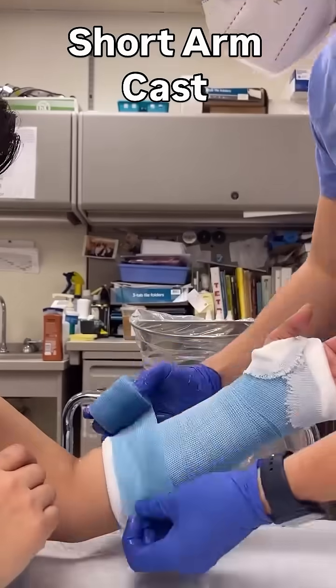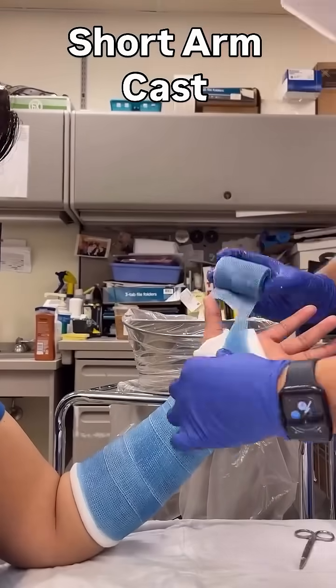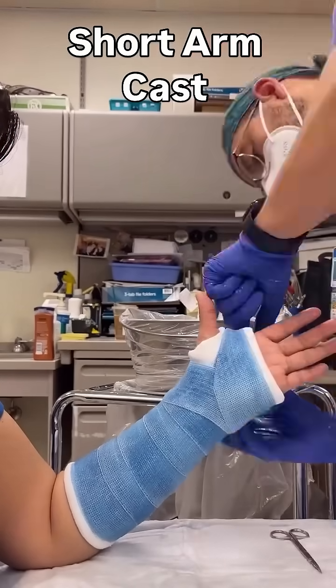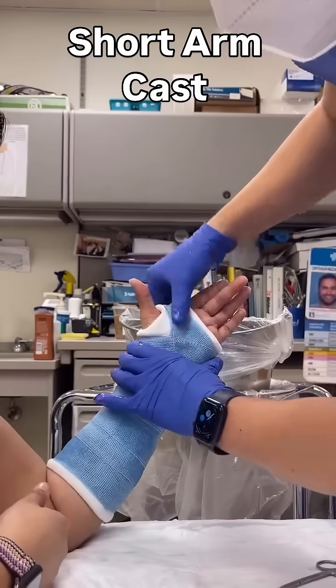Finally, we will add another layer of fiberglass. This will secure the stockinette that was flipped over and make the cast a bit stronger. Then cut the edge at the ulnar border for a cleaner finish. Now it's time to rub the edge down so that it doesn't prop up, and you're done.